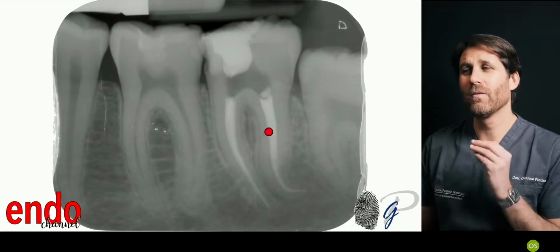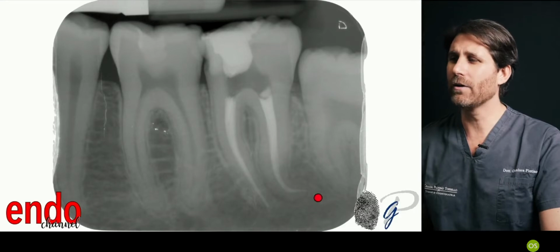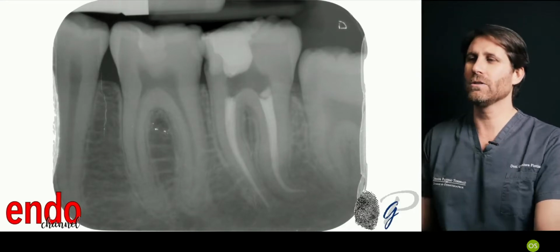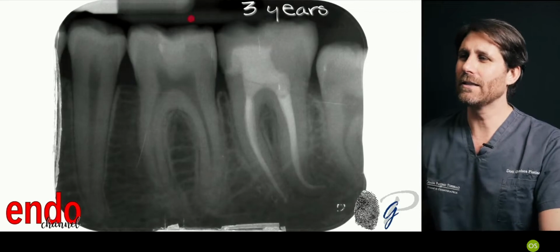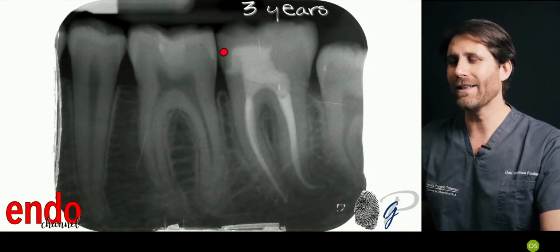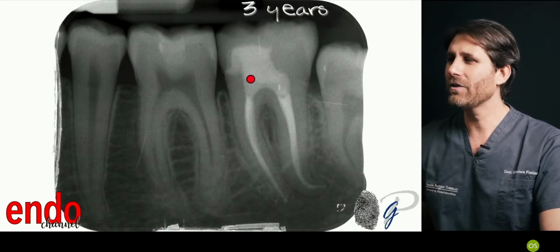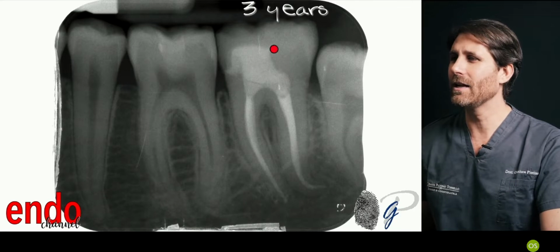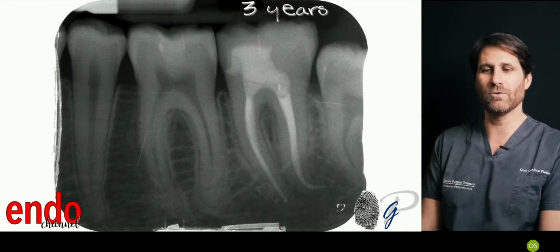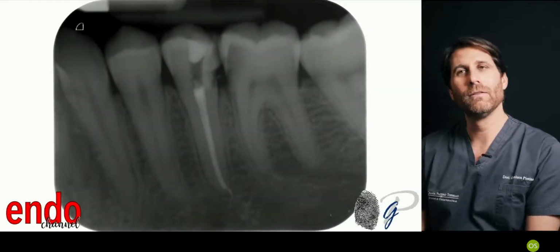Again, without compromise in the quality of our root canal treatment, with maintenance of the curvatures and maintenance of the tooth structure. This is the 3 years control with the only coronal restoration, adhesively cemented. The build-up: you can appreciate the maintenance of the axial walls, the pericervical dentin and the soffit, beveling the enamel and restoring with a partial restoration. And this is what we do day by day clinically.